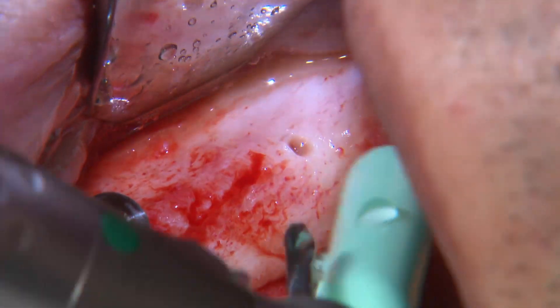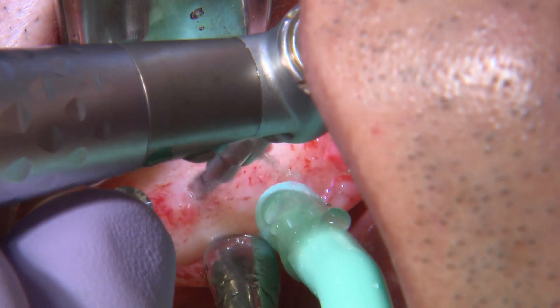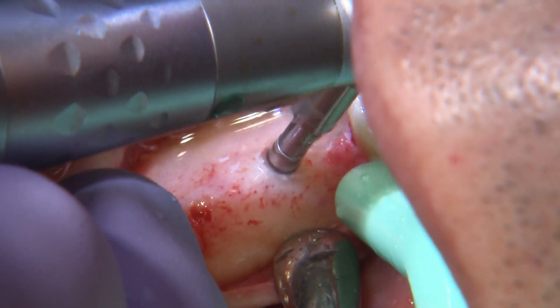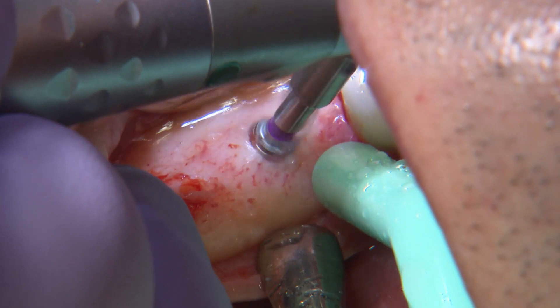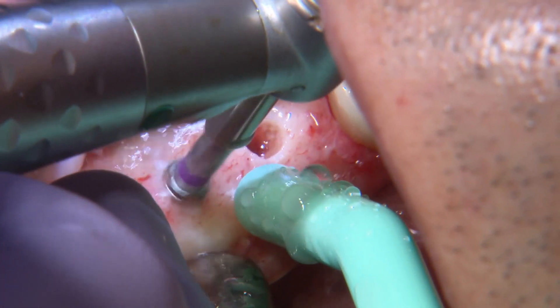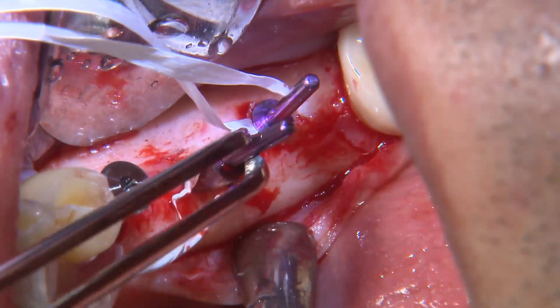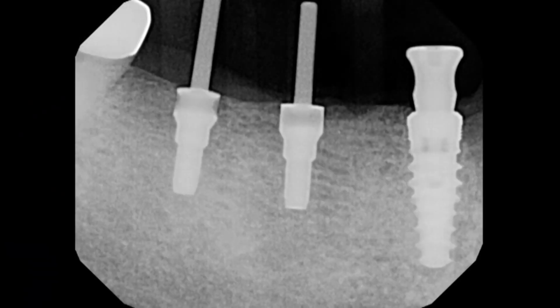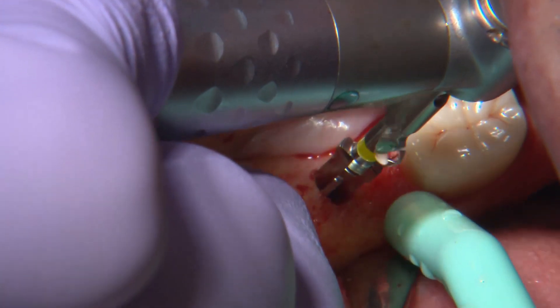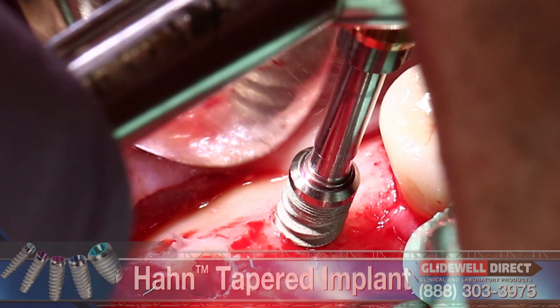I'll go ahead and create my osteotomy for the next two implants. We go with our initial drill, and again I want to check the angulation with radiographs as I'm moving along with the osteotomy. I don't want to go too far and not be able to correct my angulation with the subsequent drills in the Hahn kit. Here I'm using a shaping drill to create the exact shape of the implant within my osteotomy. Our initial shaping drill has the correct size for the parallel pins, so I can use the parallel pins within that initial osteotomy and take a radiograph. As you can see, we are fairly parallel with our angulation. It's a lot to manage — having the implants in the proper position mesiodistally and also having the correct angulation requires a more advanced skill level.